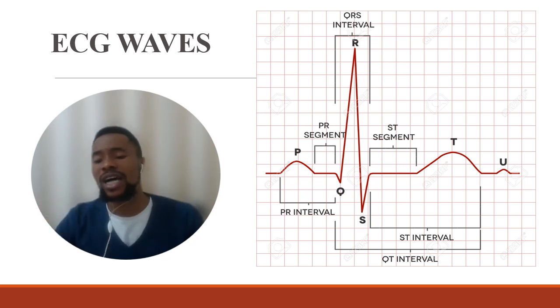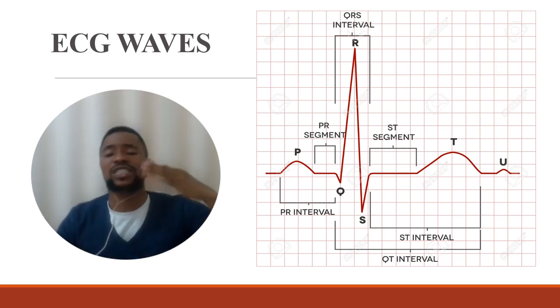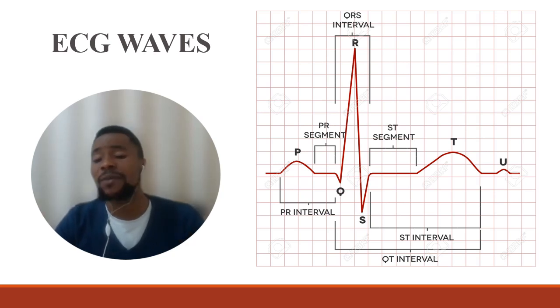Or the patient has what we call dextrocardia. Levocardia is when your heart is more at the left. Dextrocardia means that the heart is more at the right. So anything you'll be seeing in your ECG will be upside down. So how will you be able to distinguish between dextrocardia and a lead misplacement, where you're supposed to put right hand, you put left hand, and you put left hand where you're supposed to put right hand? In dextrocardia, everything will be upside down, like opposites.